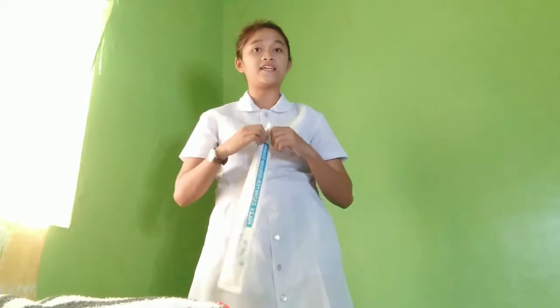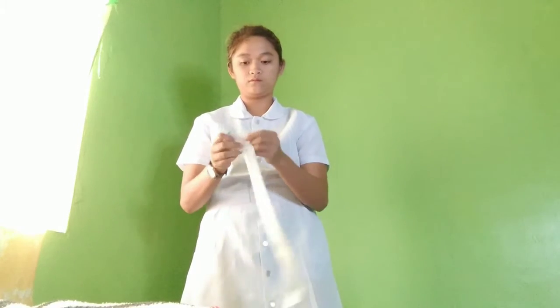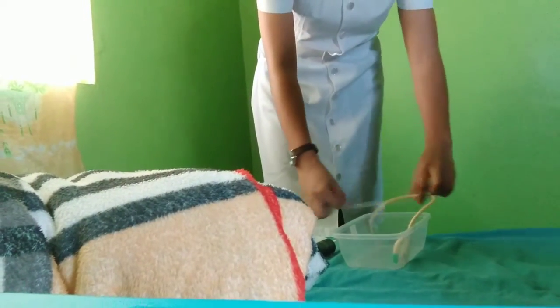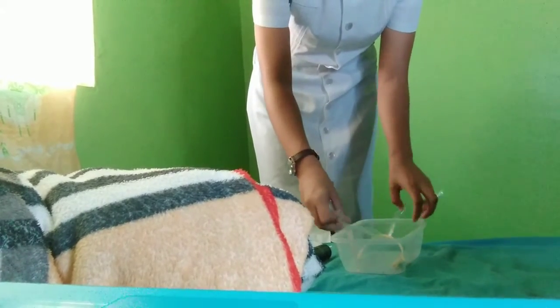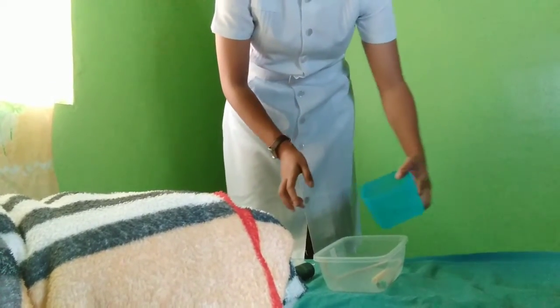The larger catheter size increases the risk of urethral trauma. Let's put a solution.